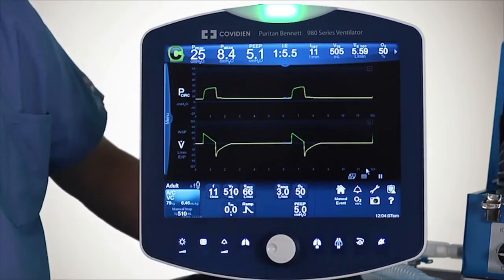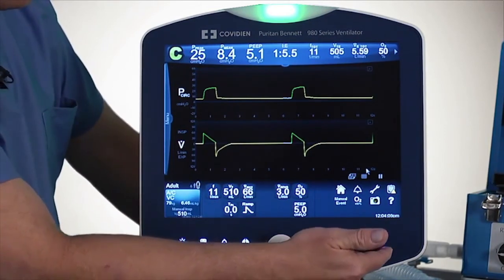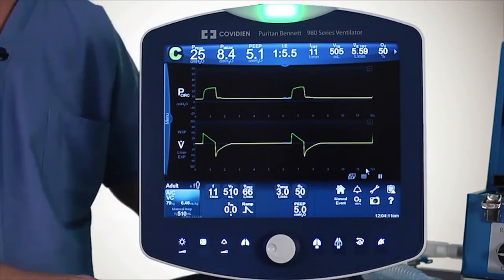And finally, the two we already talked about: the alarm reset and the actual alarm silence, which will last two minutes.